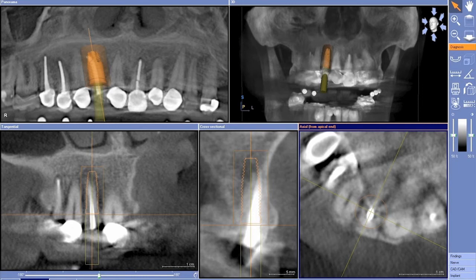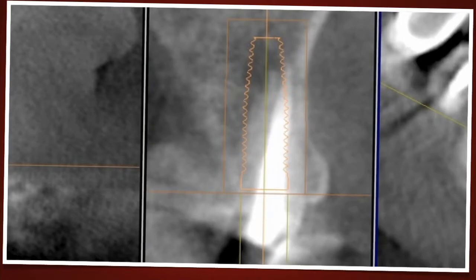And again, taking a look at this plan — let's take a closer view — we can see that we've done exactly this. By lengthening the implant beyond the length of the root, and by placing the implant more to the palatal, what this allows us to do is engage fresh apical palatal bone and gain primary stability in this case.